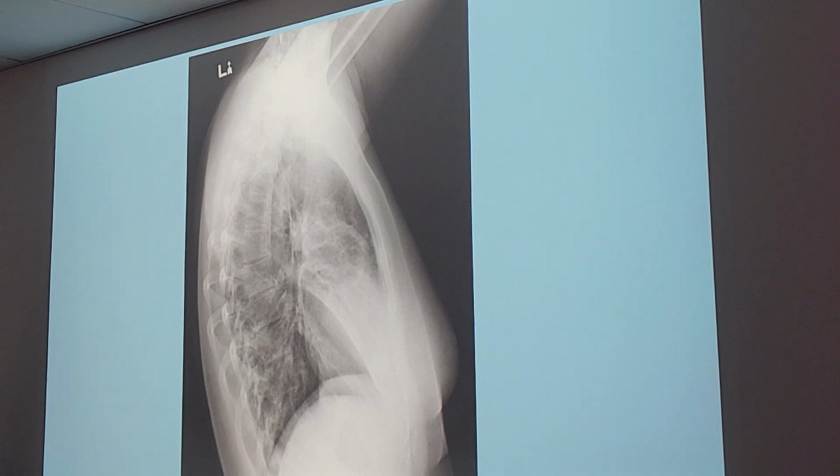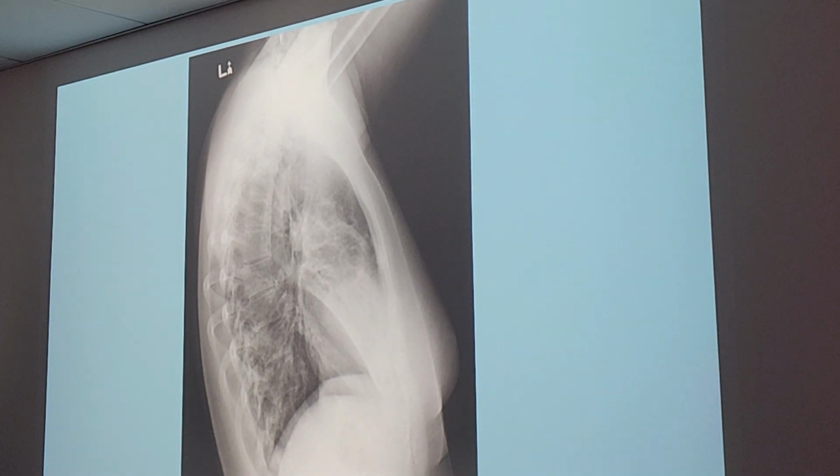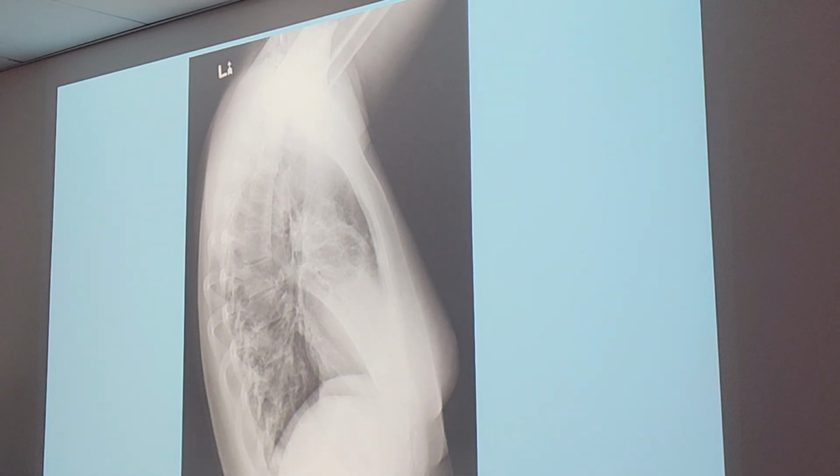Is that the clavicle? Sometimes if you overwrite it, it can. Or they probably centered it too high. Ma'am, is that the clavicle showing that way? It should not always be showing, right? Where's the clavicle? That thing going across. Shani, where is your clavicle? Clavicle is here. How can the clavicle stick out like that?